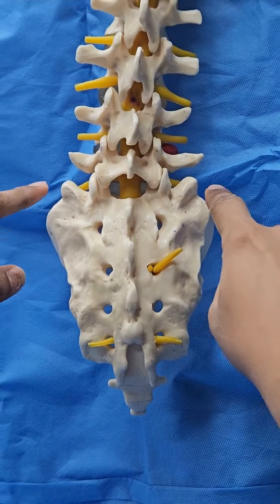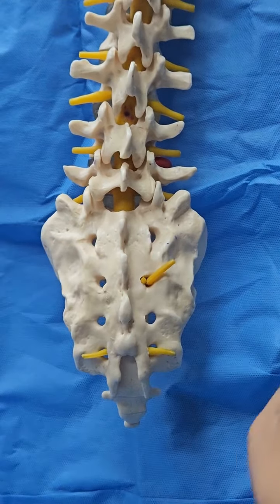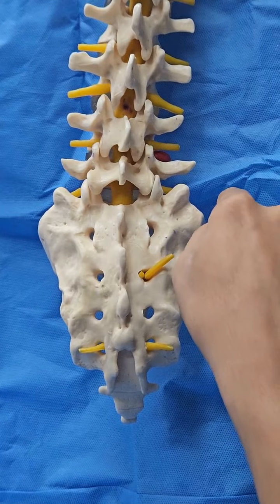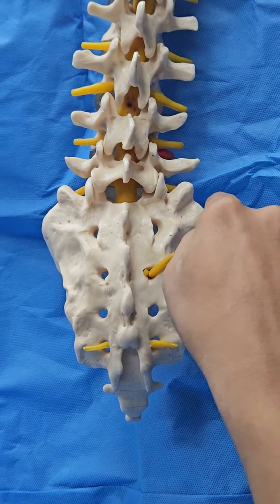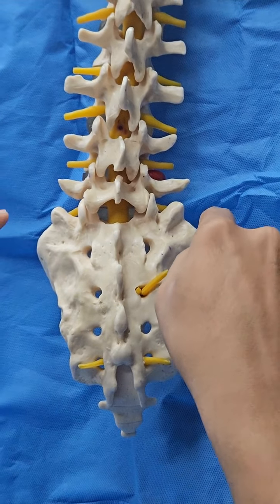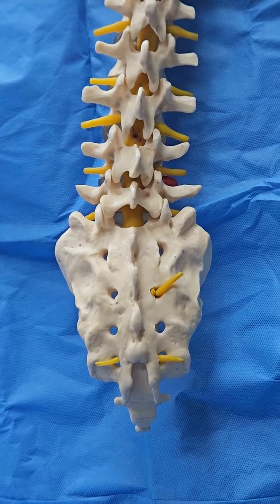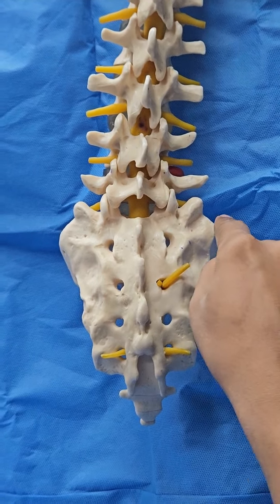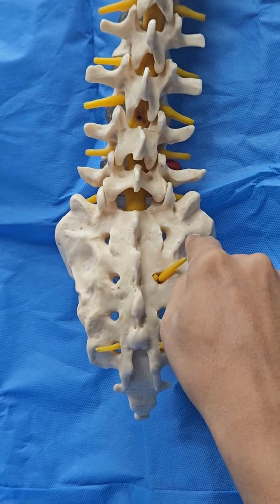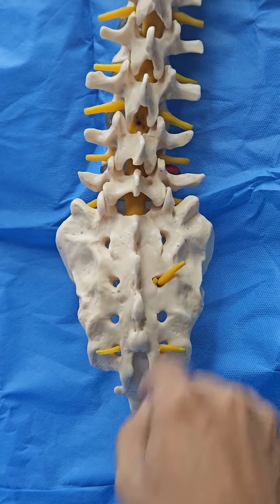First, identify the sacrum and the iliac bone. You identify the posterior superior iliac spine by palpation — that is also called the dimple of venus. Once you identify the dimple of venus, you go 1 cm below and 1 cm medial. That should be your point of entry.